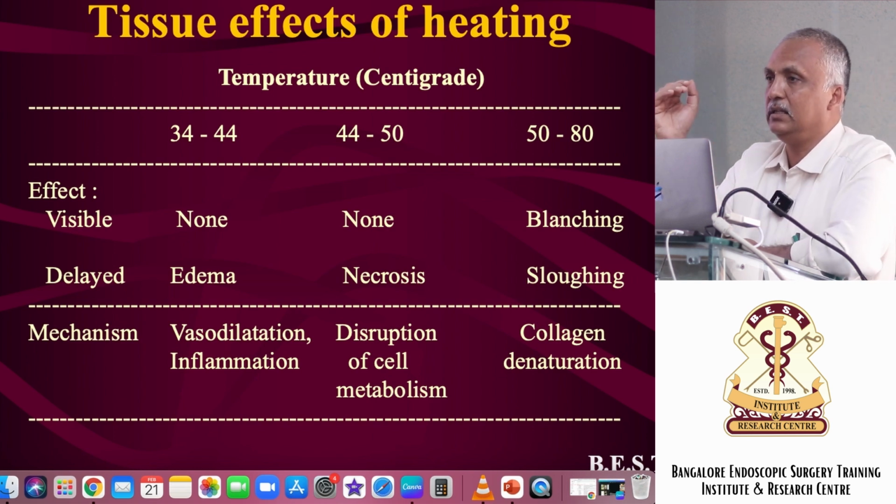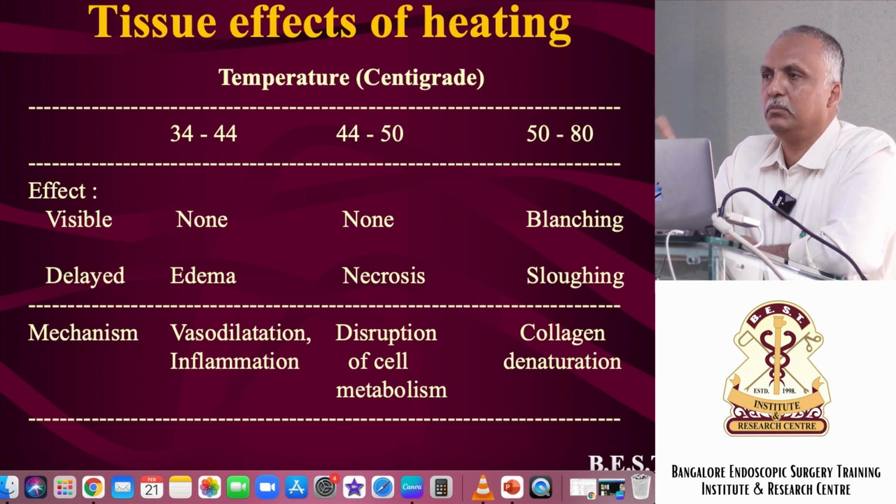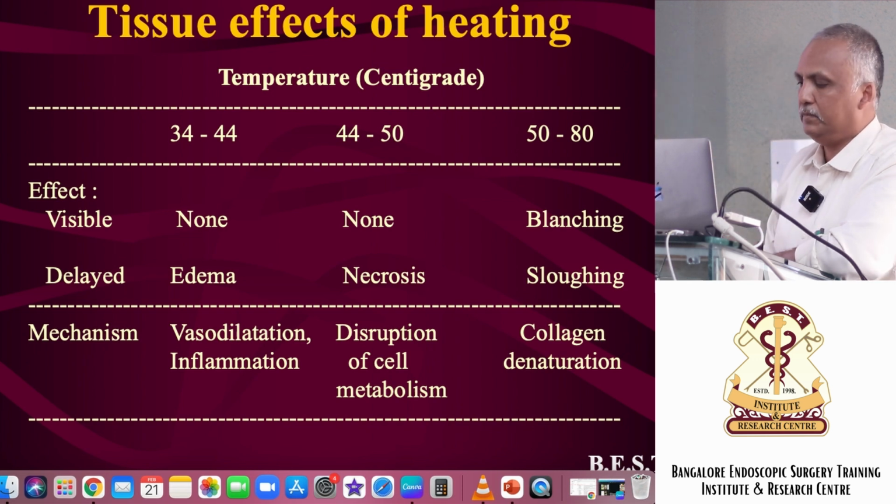And that is the reason, if anybody comes to you between the 4th and 14th day after surgery with severe pain, you must think of thermal injury. Diathermy has caused this, there is a perforation, intestinal perforation or a ureteric injury, and you have to rule that out. That is extremely important after laparoscopic surgery.